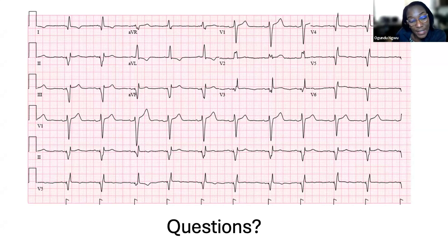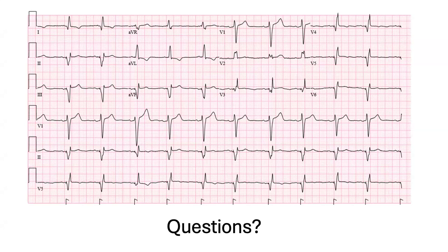If I can't get the CS lead in, I'm going to put in a pacing lead and then change his device to a device that can have the ICD lead, the atrial lead, and then I'll put a pacing lead into the left bundle just so that he can have some CRT. But again, it's a bailout option for me at this point. Perfect. Okay, that is great.